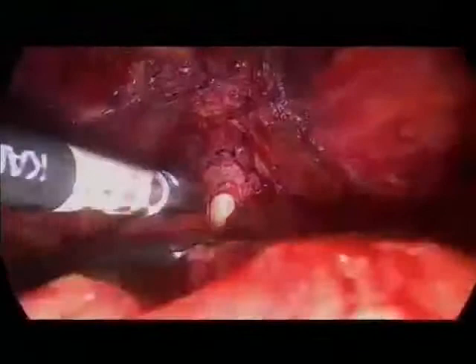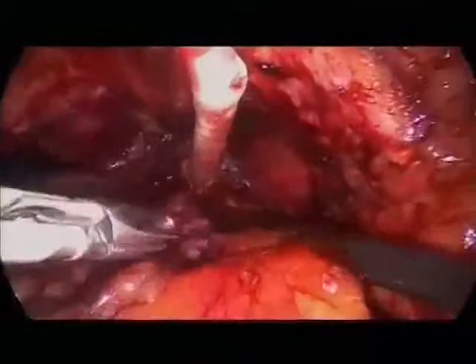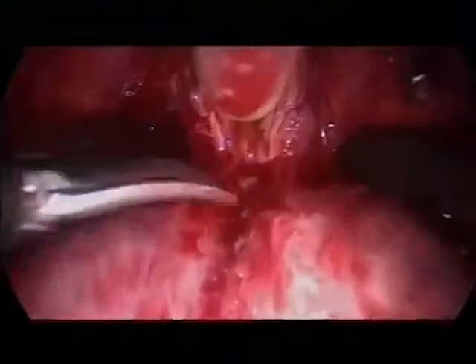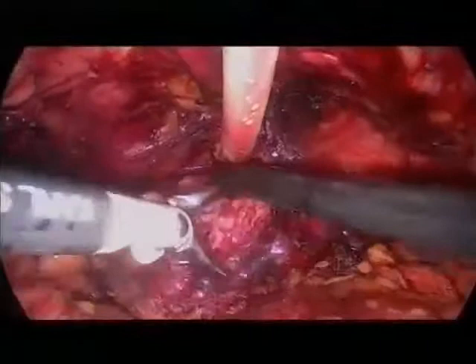So we take out the catheter, and then two steps for the posterior apex. First is here. This is the veromontanum. We go caudally. So just made a stop. Go back. Just to show. So you want always to see the veromontanum.